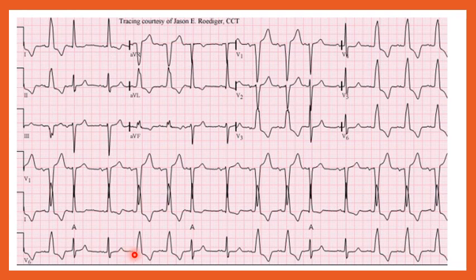The patient's rate speeds up, and when the patient's rate speeds up, the QRS widens out. And when we look up here at V1, when the rate speeds up and the QRS widens out, it has a left bundle branch block pattern compared to the normal QRS here, a rate-related left bundle branch block.